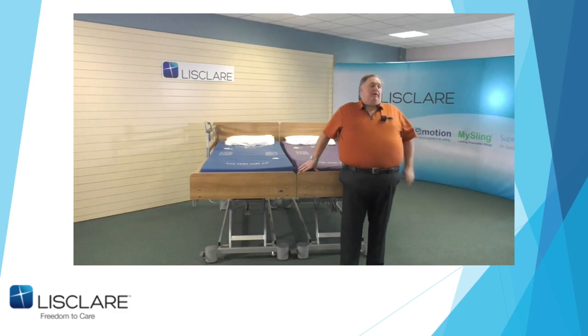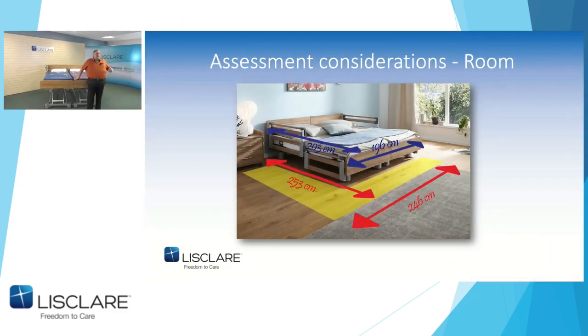In that picture, say the patient was sleeping on this side of it and the partner was sleeping on the window side, the carer still needs maybe to get into the far side to the empty bed because it's lighter and you need to move it towards the window. And that's that sort of risk assessment you need to look at, that sort of footprint.